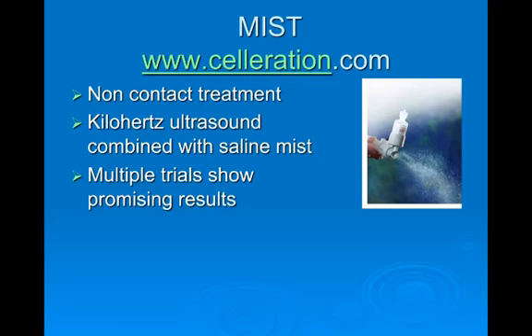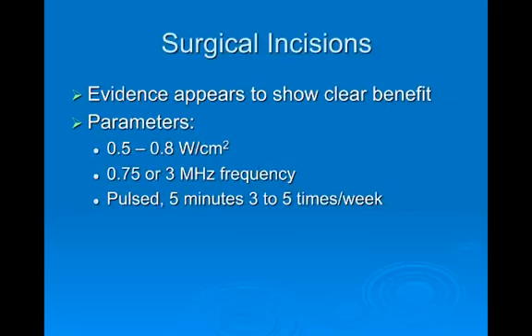There have been numerous trials that have shown some pretty good results with this, probably due not just to the ultrasound, but also to the gentle debridement that they're getting from the mist therapy. So something to take a look at, keep your eyes open for, especially if you're getting into the wound care realm.